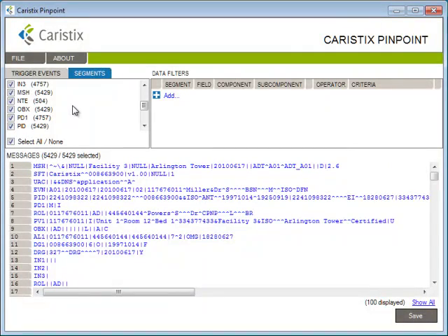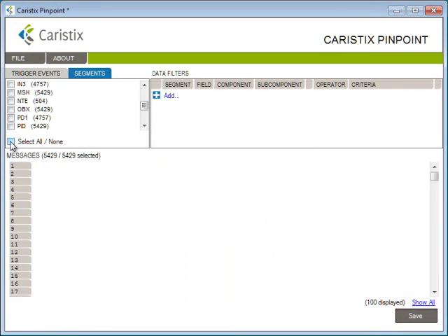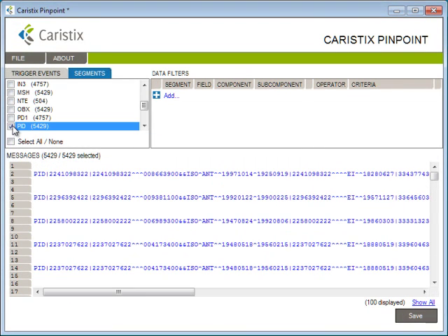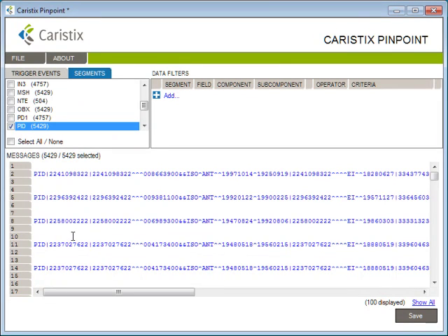Let's say you're looking for the PID segments in this log. So you'd go ahead and make sure you clear your checkboxes, and then just select the PID checkbox. And there you have it. The PID segments are down here in the messages area. You've just isolated the segments you need to focus on.